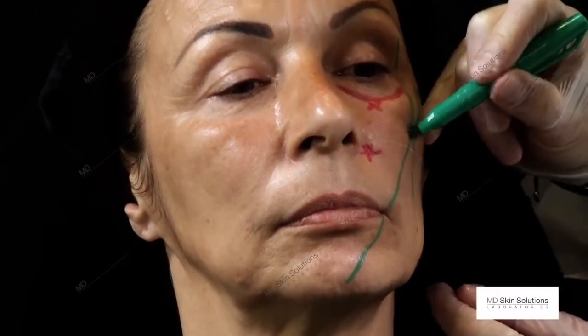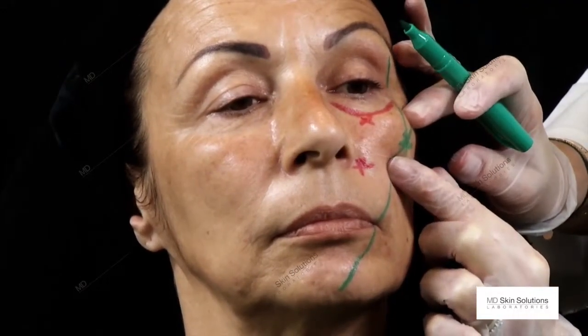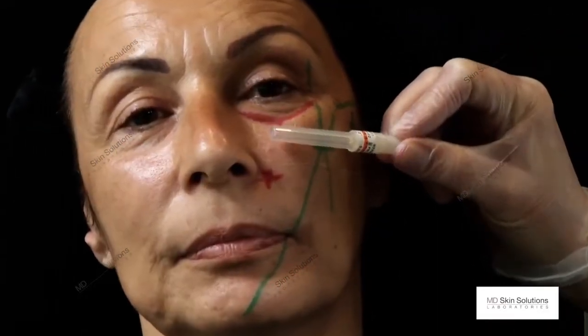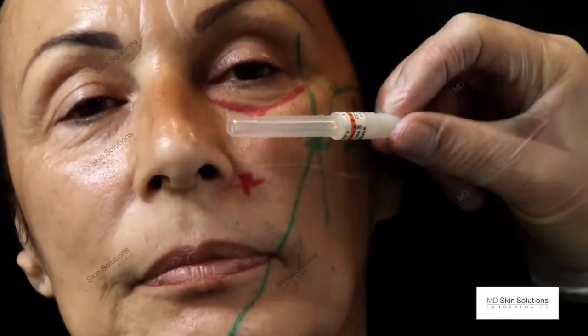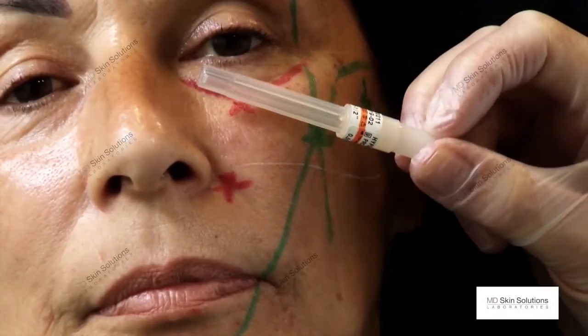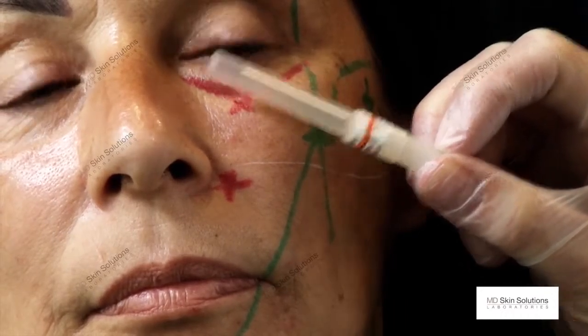This is the highest point where the cheek apex point should be, has been, or will be after the treatment. I can reach out for the whole frontal projection, for the whole area where I will recreate the frontal projection, and even the tear trough from this point.